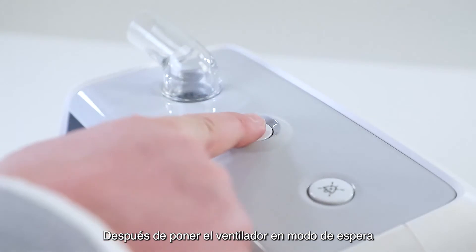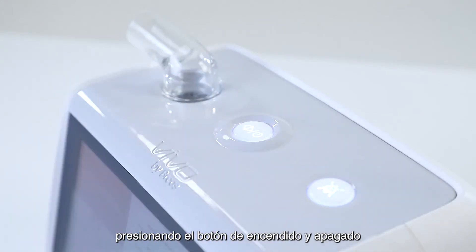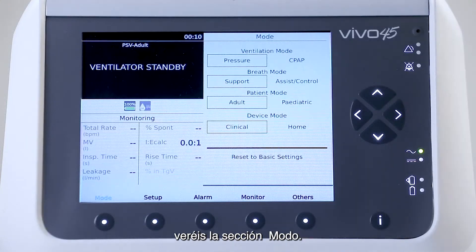After you have put the ventilator in standby mode by pressing the on/off button on top of the ventilator, you will see the mode section.